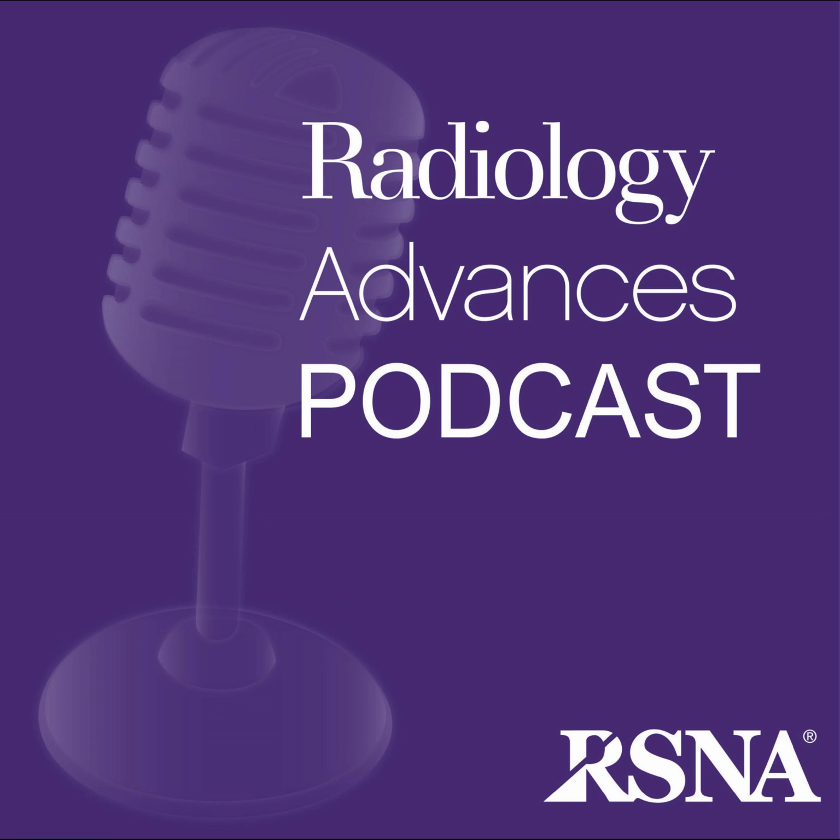Now, we've established the volumetric results are stellar, but the authors did note a little nuance. While the volume agreement was high, the DICE score, the segmentation metric for SYNC MRI, was a little lower than a perfect score against the true contrast-enhanced MRI. Why was that? Yeah, that's a subtle but important point. They think it's due to a slight smoothing effect from the synthesis process. The deep learning model, while getting the overall volume right, might just slightly blur the absolute sharpest edges compared to a true contrast image. So you're trading a bit of boundary perfection for avoiding contrast administration.